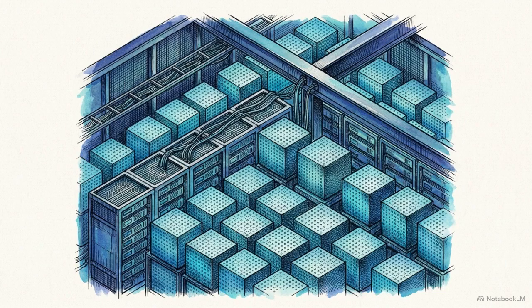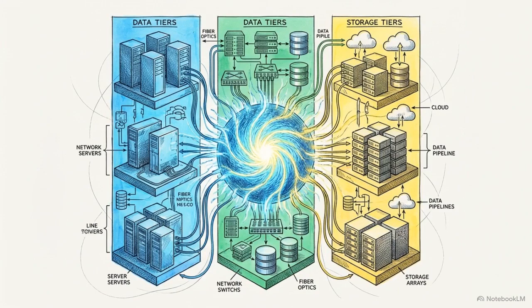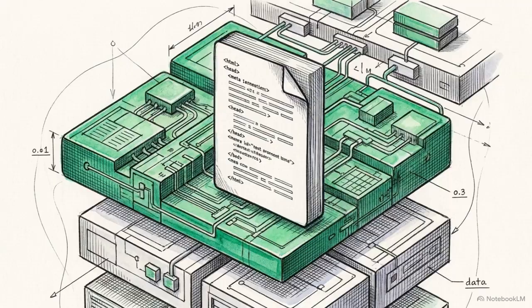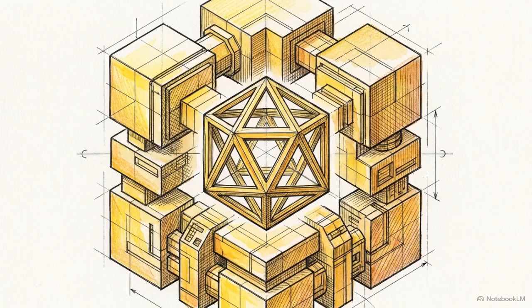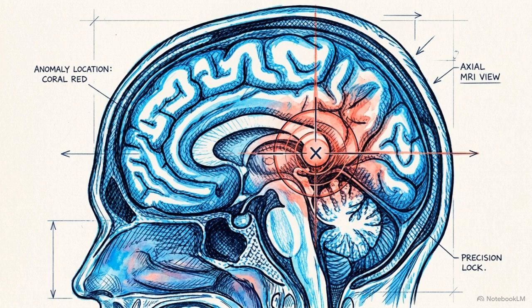Once the file is stored and streamable, the database faces a second hurdle: how to search the content of the image. True multimedia databases utilize a three-tier model: raw media data, descriptive text metadata, and structural features. Descriptive text is limited. Searching date created cannot identify a specific density anomaly within a scan. Searching the image itself requires the third tier, content-based image retrieval, or CBIR.